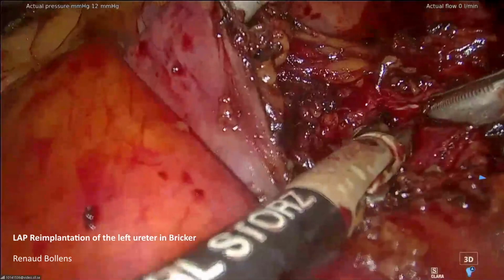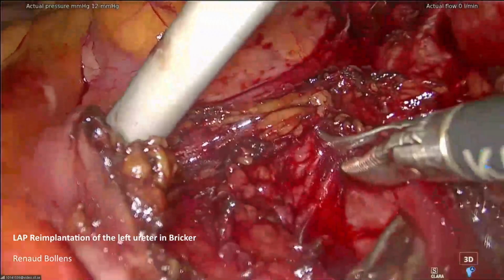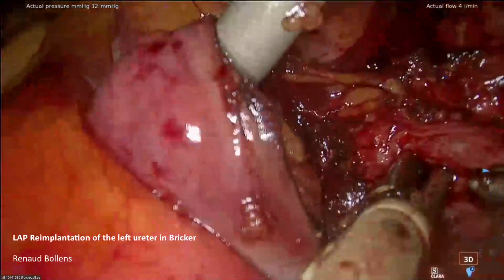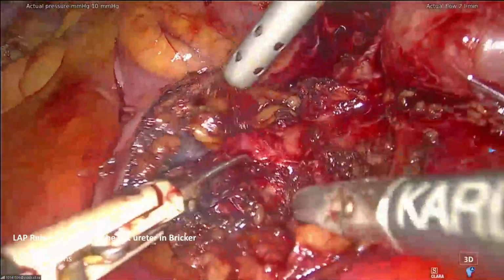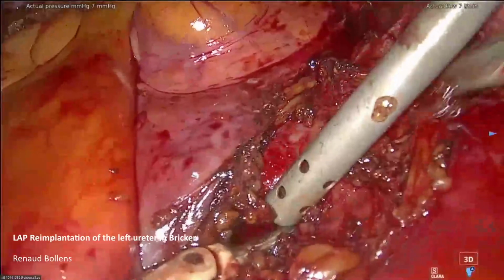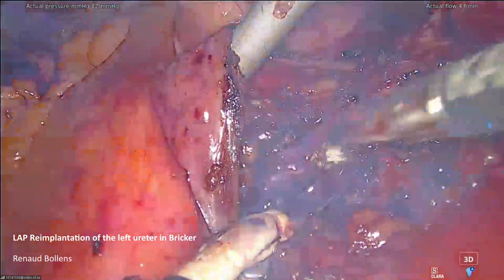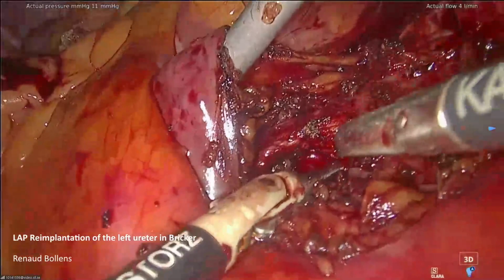This is the reason why I think it's important to be sure about the quality of the suture, if possible. And also that the vessel is the same as the other side. Okay. And for me, the key is traction, vascularization, and water tightness of the anastomosis. I don't know if you have the same sensation as me. Yeah. But you know, I always say, in surgery we believe a lot of things, but you are sure of nothing. I think that is the reason, but I'm not sure about that.